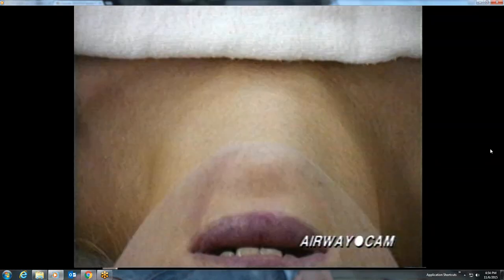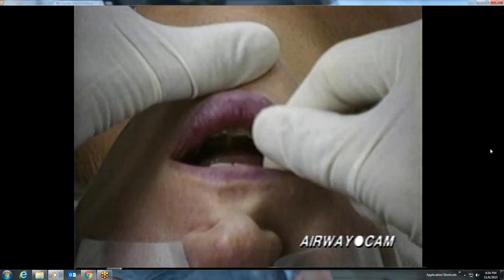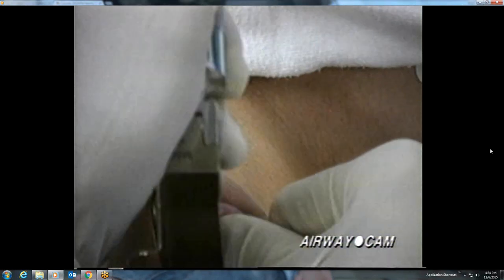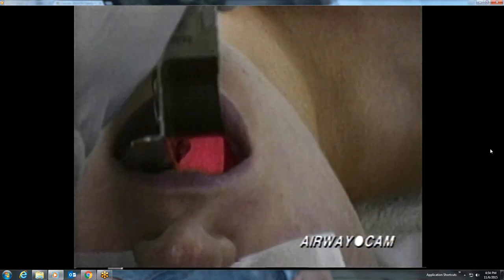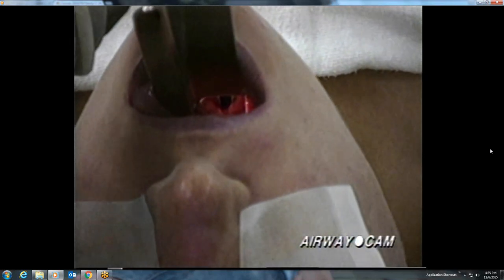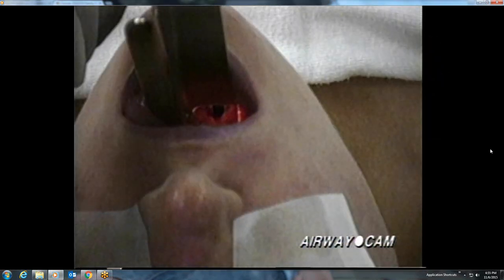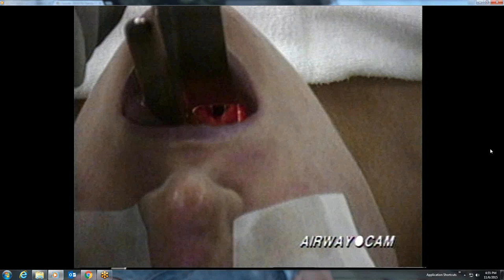The second laryngoscopy on this patient is with a Macintosh No. 4 blade. Following a scissor technique opening of the mouth, the posterior pharynx comes into view. With advancement of the blade and head lift, a good — although somewhat dark — view of the larynx is obtained. Note the effect of head lift as the larynx comes in and out of view. The tip of the epiglottis can be seen under the edge of the blade. The posterior cartilages and interarytenoid notch are clearly seen; the glottis is relatively dark and the true vocal cords are not visualized.